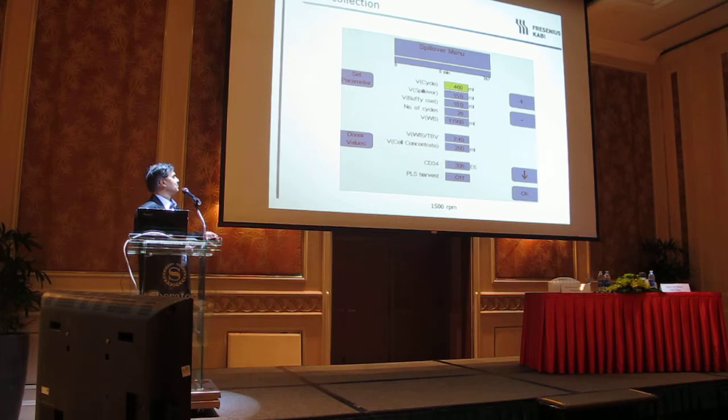So the machine normally moves at 1500 RPM, but the RPM can also be adjusted depending upon the count. So CD34 is our target, and the machine will keep on processing the number of cycles. It will tell you how much time it is taking. Accordingly, this bar will continue and will end once the timing is complete. So the machine tells you the approximate time and the yield.